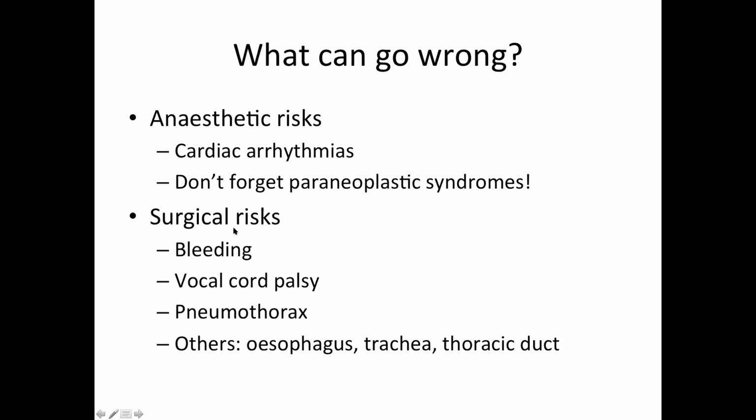These are the things that we're going to be thinking about a lot more. Bleeding is the one that we've mentioned to everybody. Majority of times that there's bleeding, as I say, we can pack, and keep in mind as well the issues around redos. Sometimes following previous cardiac surgery, it is still possible to do a mediastinoscopy.